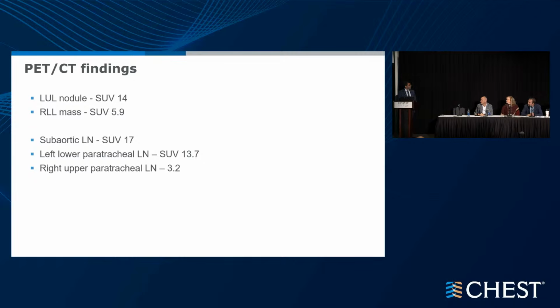This is getting interesting. Can we ask questions? Yeah, please. What kind of bronchoscopy are you performing, Dr. Lentz? Are you going for periphery or are you going for lymph nodes? Good question. In this case, I don't know that there's definitely a right answer.